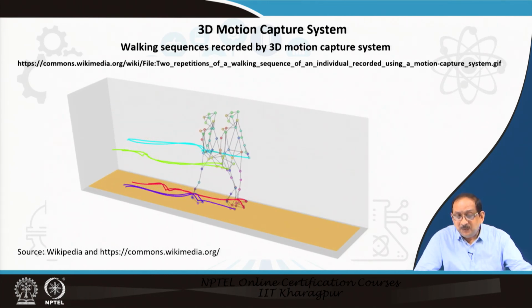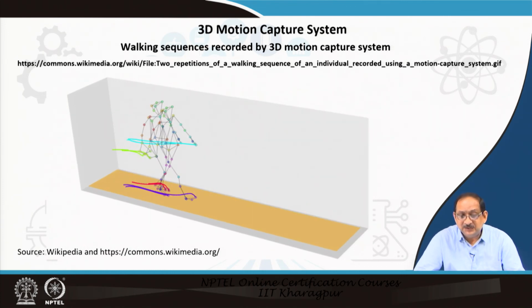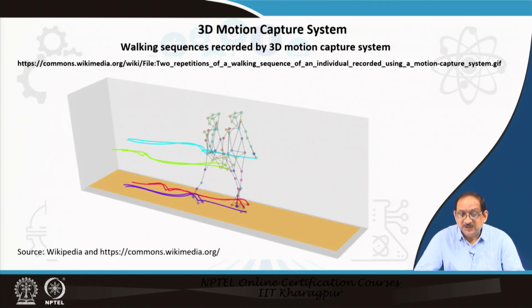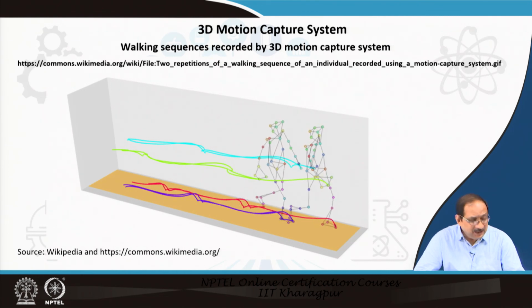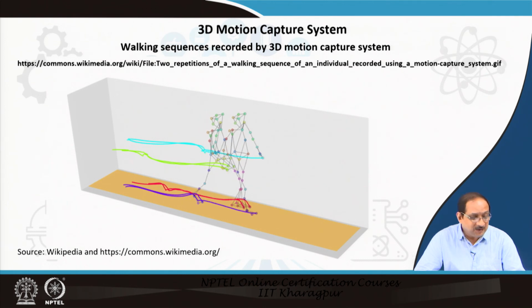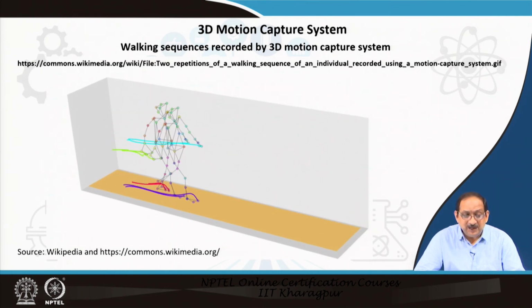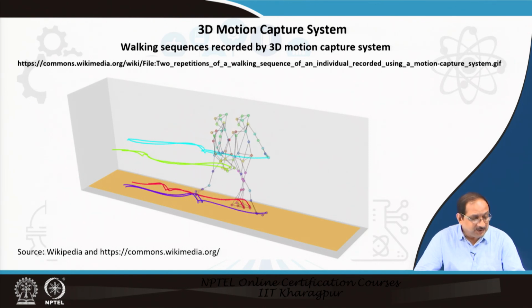So, there is no subject or human being in this walking sequence. It is basically the recorded trajectory of the markers that is very clearly represented in this animation.